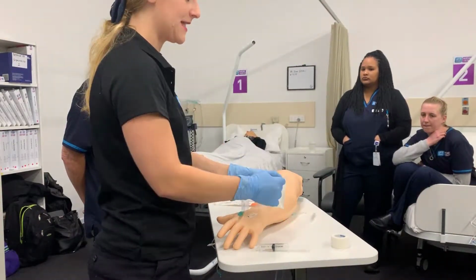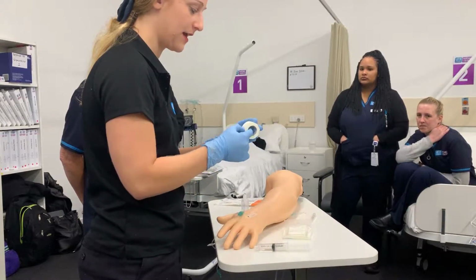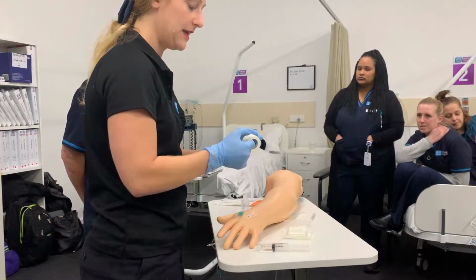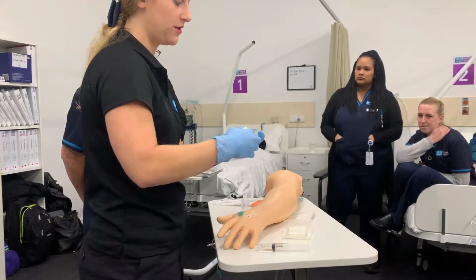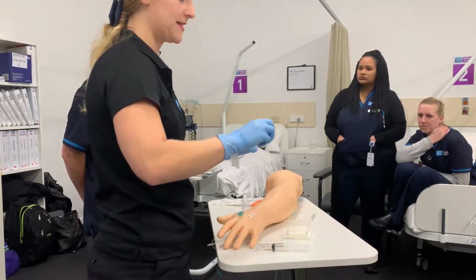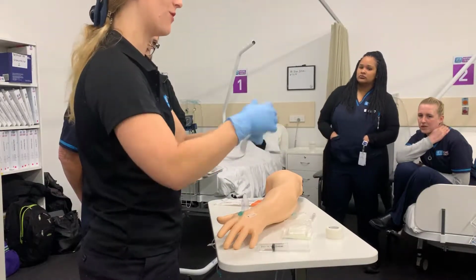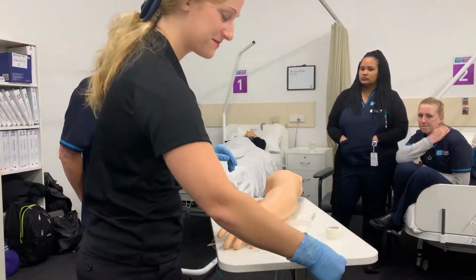So with that being said, I like to have gauze ready. I also like to have a strip of tape ready in advance, because as soon as you take that cannula out, one of your hands has to be applying pressure, and that's not a good time to be opening a gauze package or getting a strip of tape together.